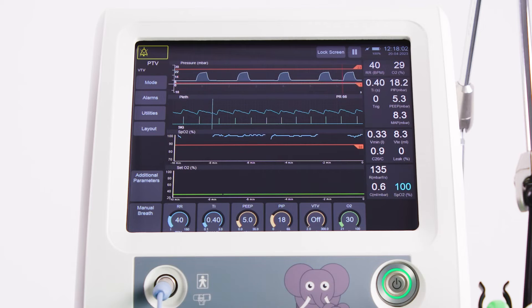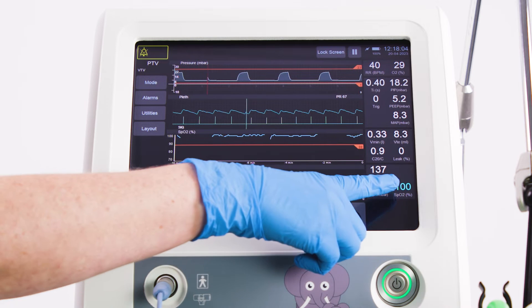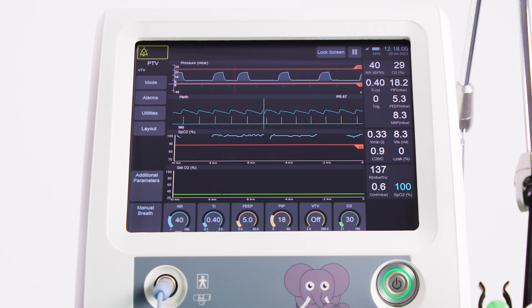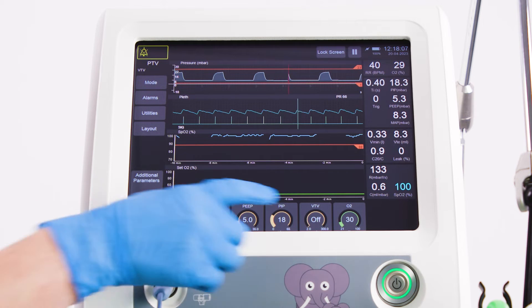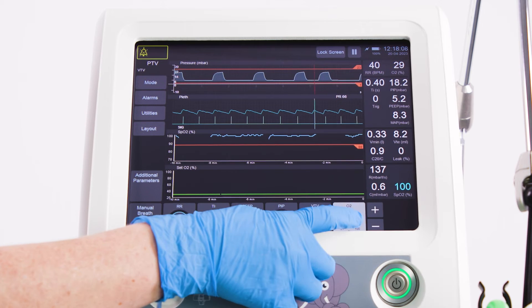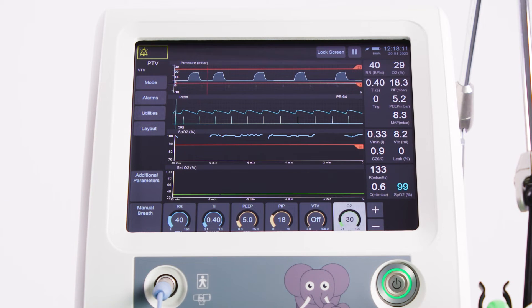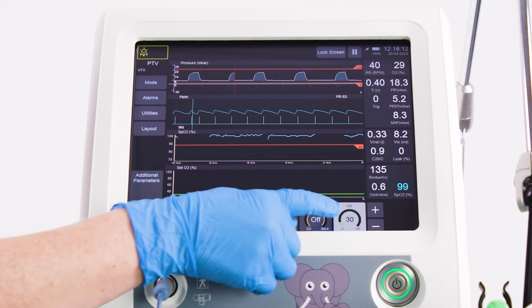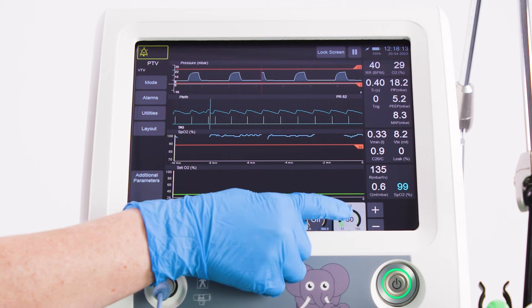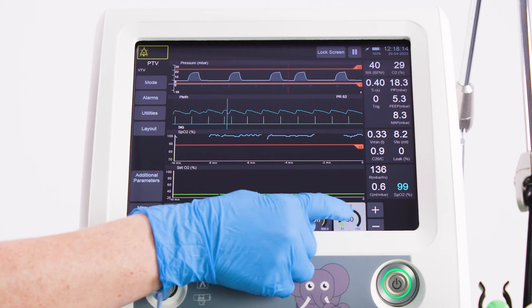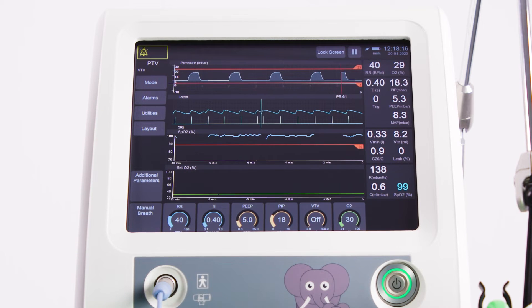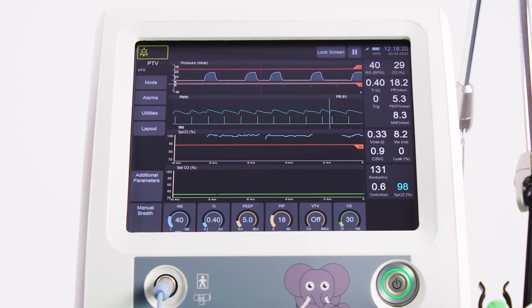When SpO2 monitoring is established, the user should manually adjust or titrate the O2 delivered to the patient by using the O2 parameter and the plus and minus controls. Monitor in steps until the patient's measured SpO2 is in the desired target range.